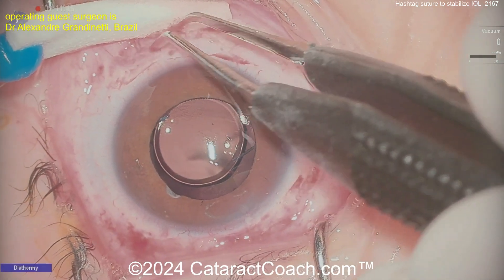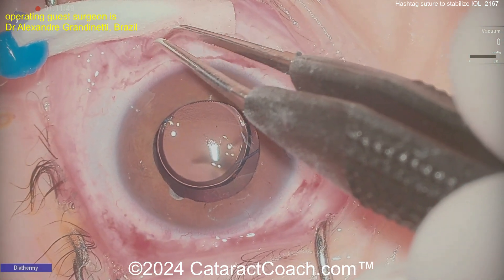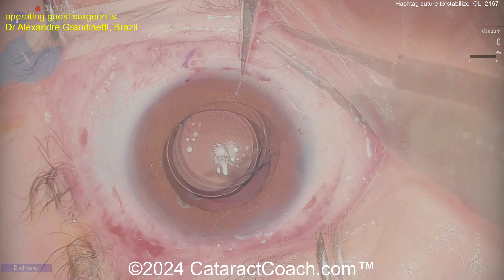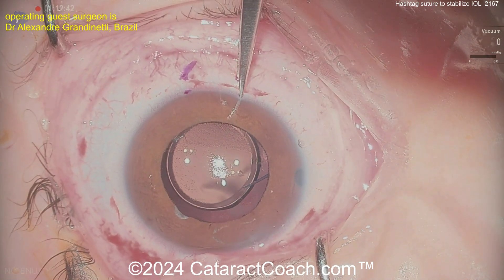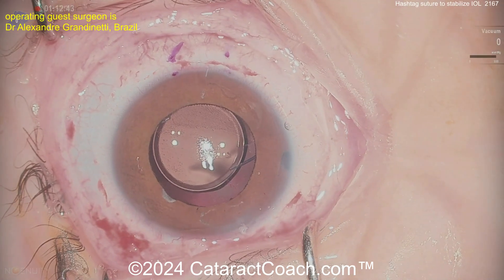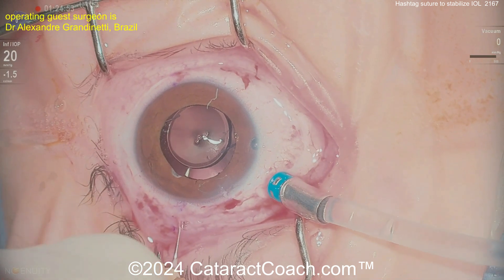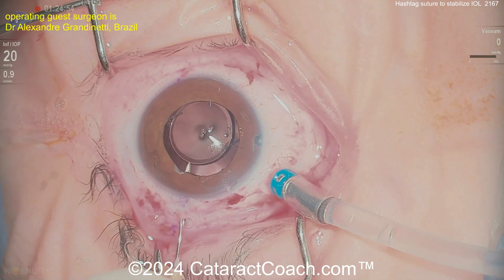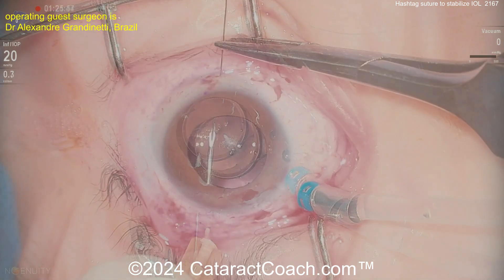The problem the patient's having is that this young, active patient is sometimes so active — running around as young people do — where that IOL optic becomes captured and comes in front of the iris. That is a problem, as the patient then has to be brought into the clinic, placed in a supine position, and hopefully the optic falls back. So our surgeon here says, let me figure out a better way of doing this.